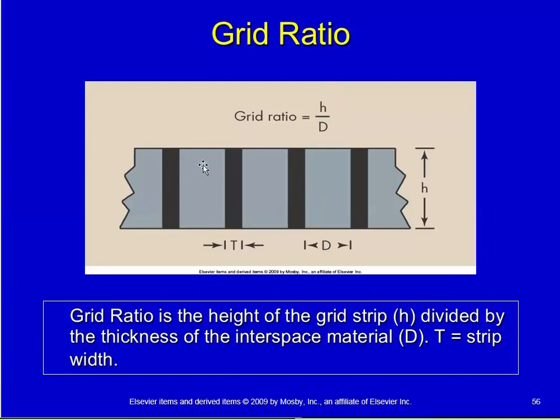But if I reintroduce the grid strips in between, so that I take this grid and I cut it in half, but somehow or another I mash it down to where this upper portion of this grid strip is now here, then what I do is I reintroduce that lead.